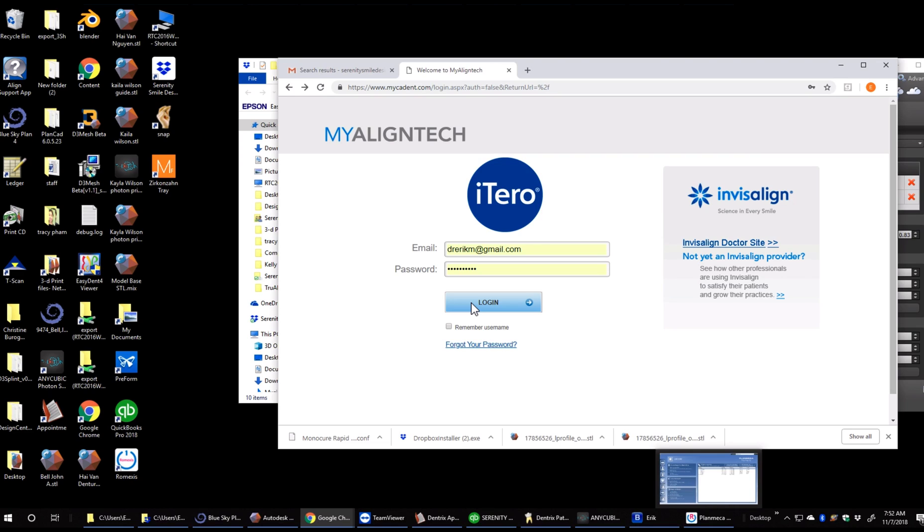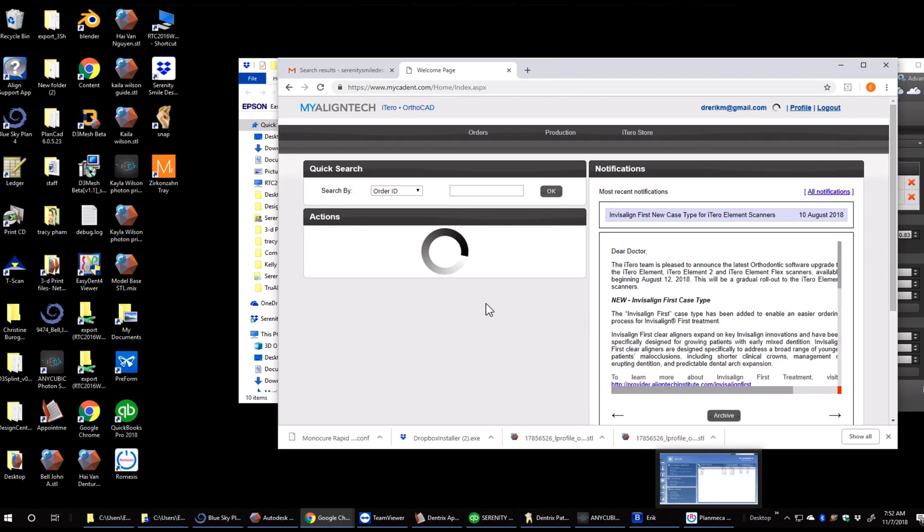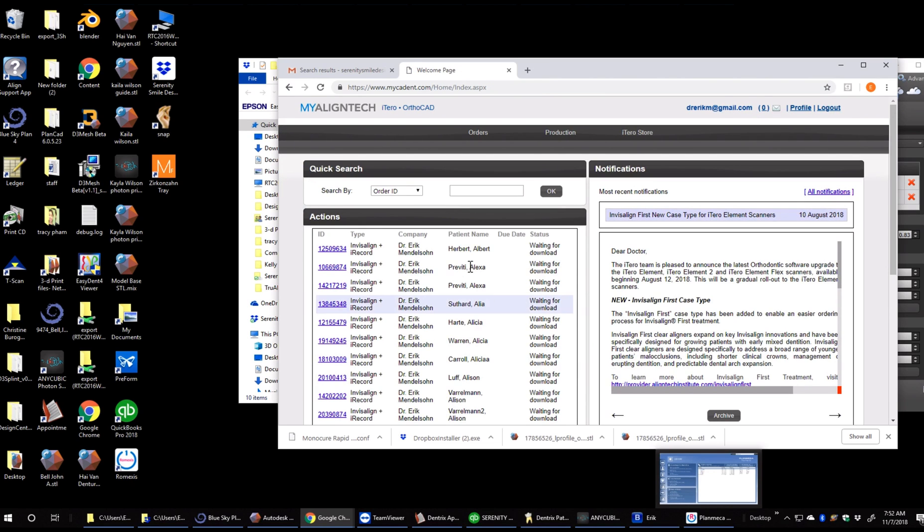And these files can be used to 3D print in office. They can be used to send to an outside lab. They can be used in Blue Sky Bio. A lot of ways we can use these files.